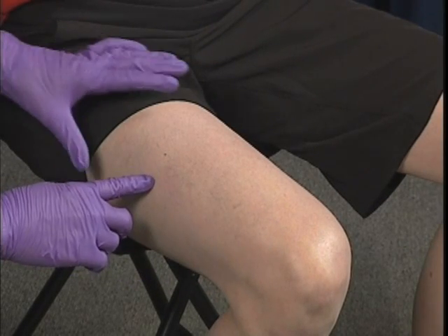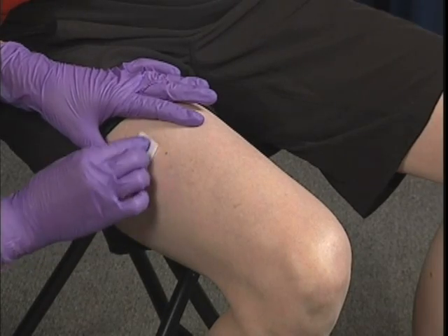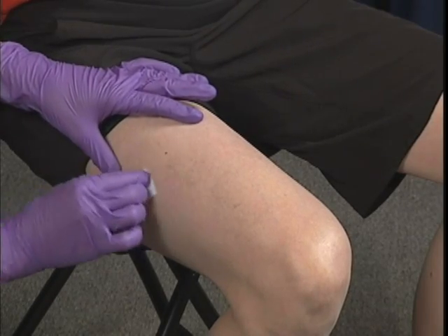Assure the proposed site for injection is free of inflammation, swelling, infection, and any skin lesions. Never recap used needles. If blood is present when aspirating, withdraw the needle and discard the medication. Start over with a new medication and a new site.